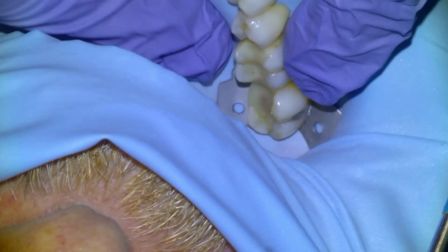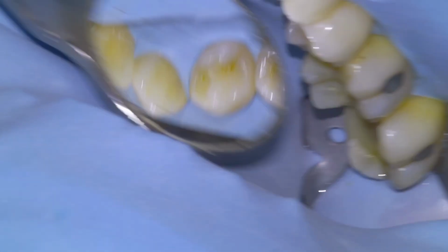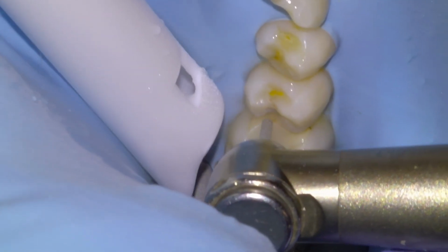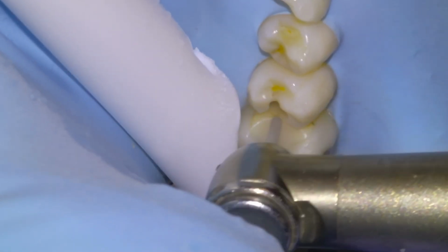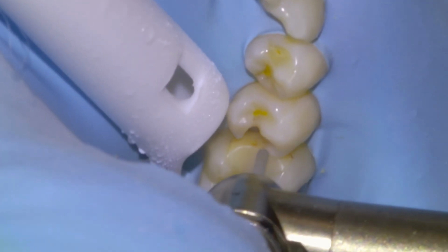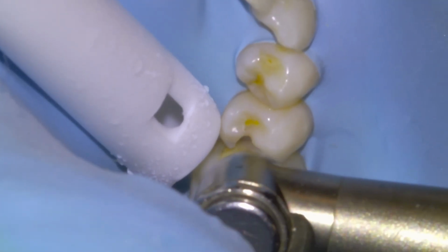Going to begin by getting a rubber dam on. And then there's the lesion there. Pretty deep one, so we know it's going to be big. Going to grab a KS1 burr for the high speed and a small carbide for the slow speed, and just get going with our preparation here. Lots of water. We know that we're going to be getting close to the pulp, so we'll try to keep the tooth as cool as we can.